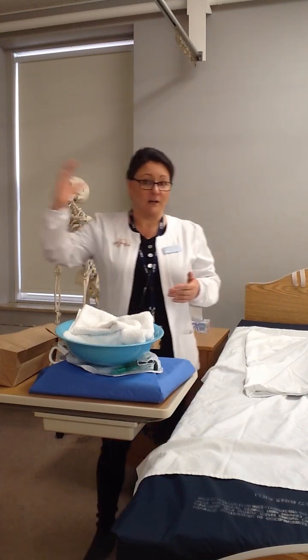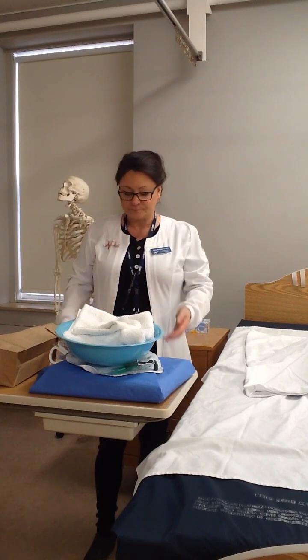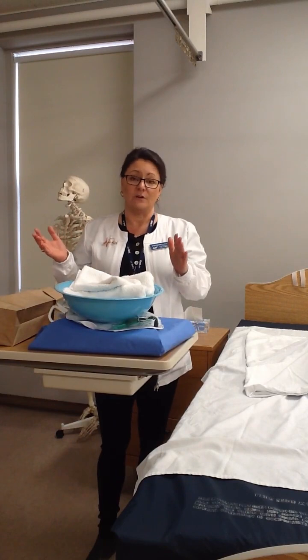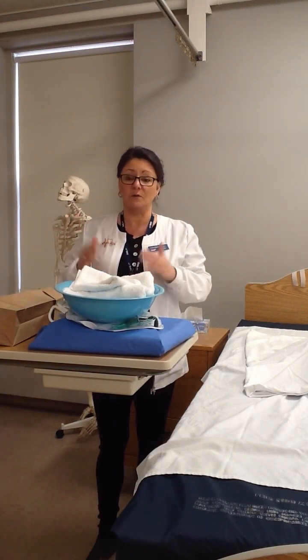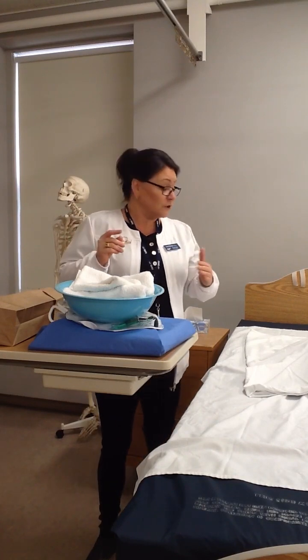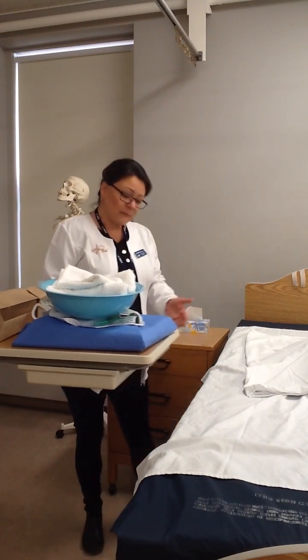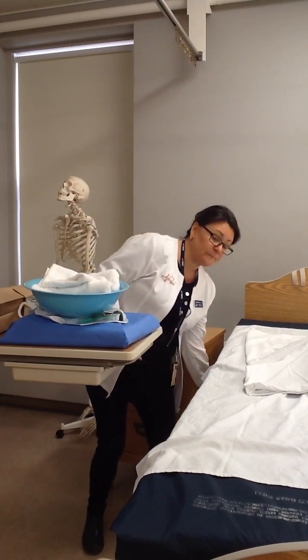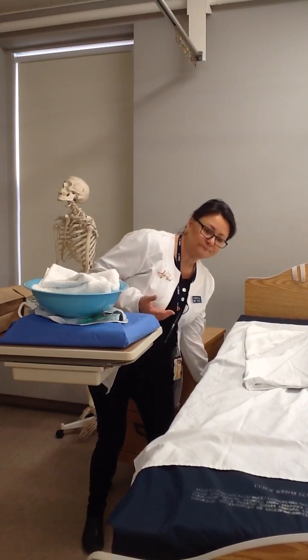So I've gone and gathered my equipment and I'm re-entering the room and starting to set up my station now. You can see I have this bedside table, so we're going to start applying our principles. I'm going to raise that bedside table to be above my waist so that I'm maintaining the first and most important principle. Anything that is below the waist is considered unsterile or contaminated. And then I look to my bed and I can see that it's not congruent with the height of my table, so I'm going to go ahead and raise my bed up nice and high.